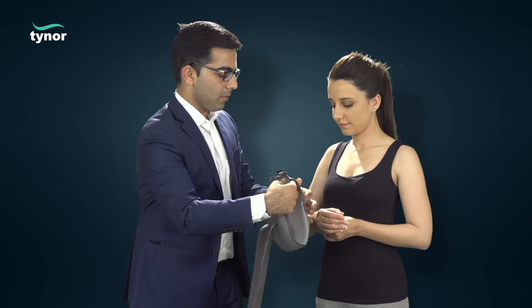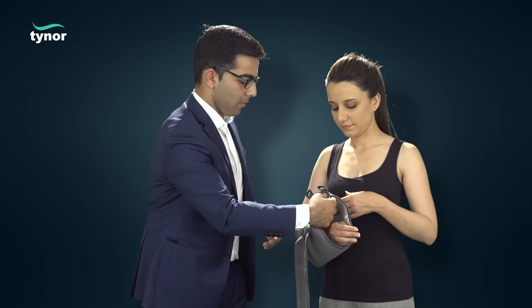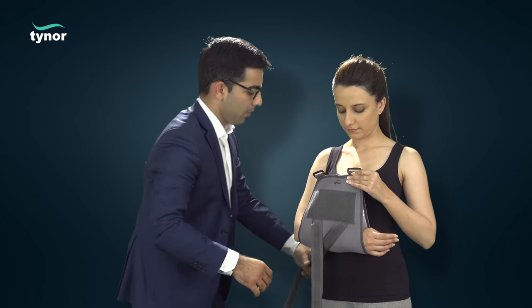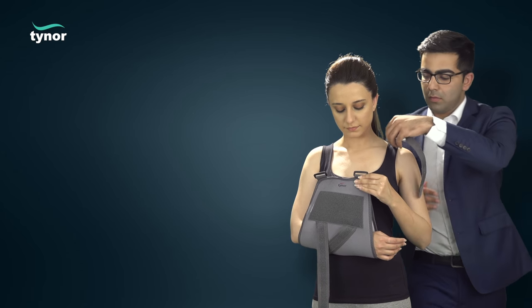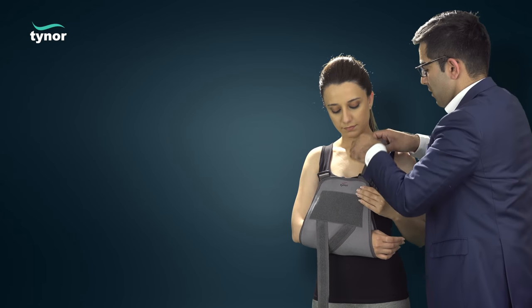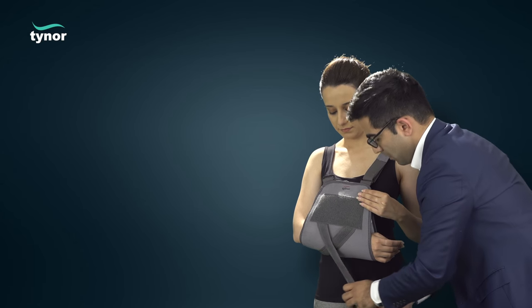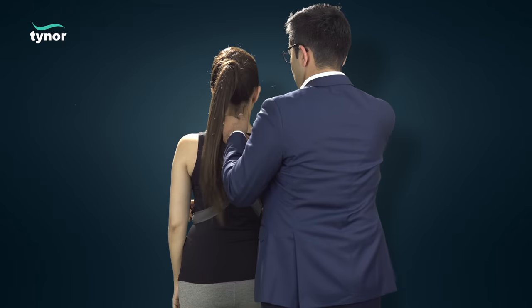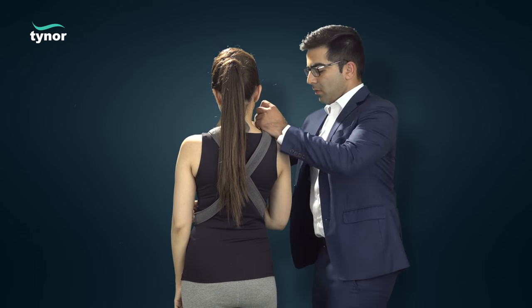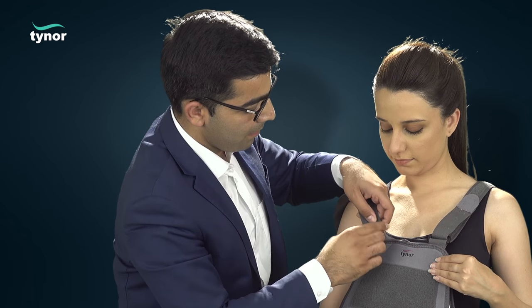The injured arm is made to snuggle into the pouch with the velcro facing upwards. The straps stitched on the pouch are taken below the injured arm and crossed at the back. The straps, after being passed over the shoulder, are taken through the reverse buckle.